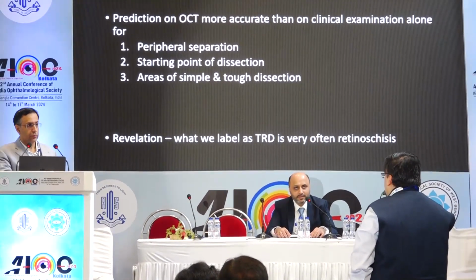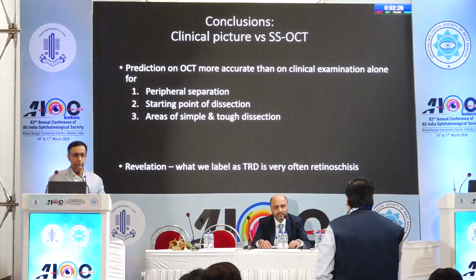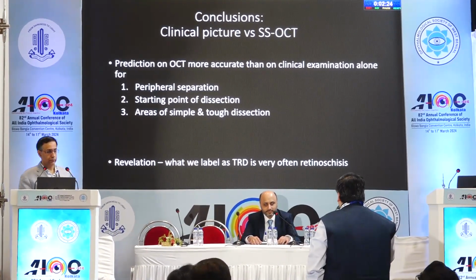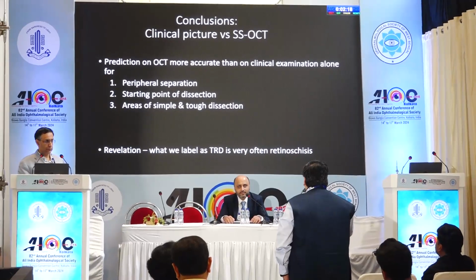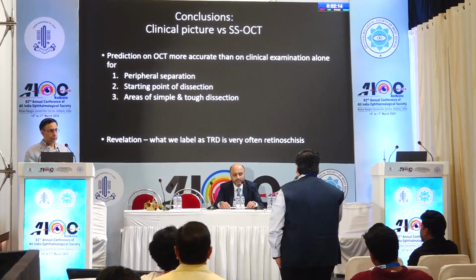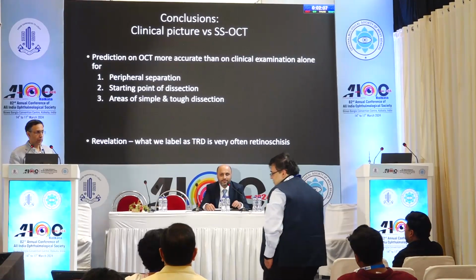Intraoperative OCT starts to help us in cases where there are vitreous hemorrhages, where you can't really do a preoperative OCT. You do a vitrectomy on table, you do an intraoperative OCT, especially if you have done macular dissection, you're not sure whether you have a full thickness hole or a lamellar hole underneath it. You want to tackle the ILM or you don't want to tackle the ILM. That's the most useful thing that I have found in intraoperative OCT. Thank you.